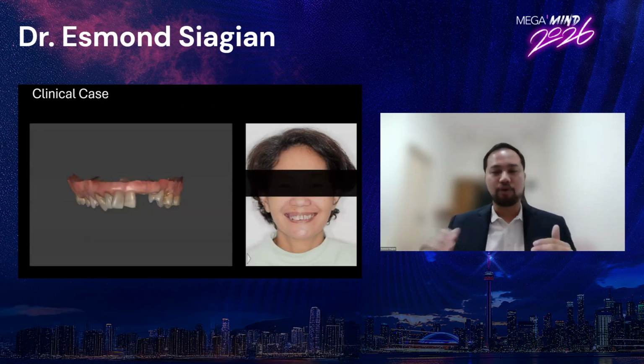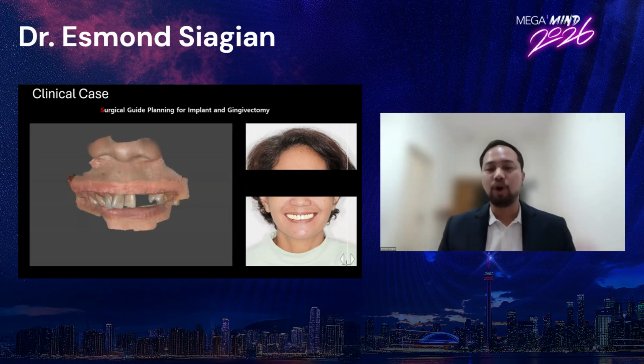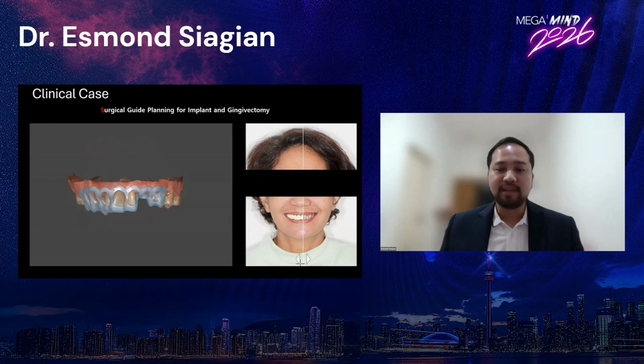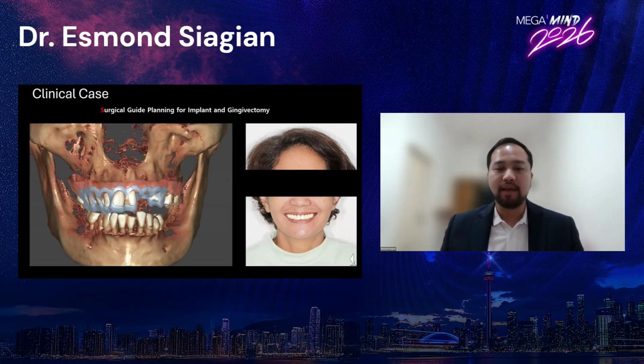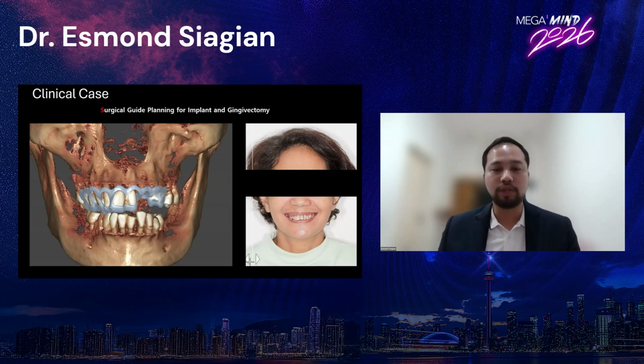Before I start, of course, I talk about plan before plan. So I plan very carefully following the digital smile design. We plan and design the surgical guide for the implant and the gingivectomy. We have opted for gingivectomy without ostectomy, because we can see from the gingivectomy guide that the guide doesn't intervene with the bone. Even after we do the gingivectomy, there's still a good amount of soft tissue before it touches the hard tissue, or the bone.